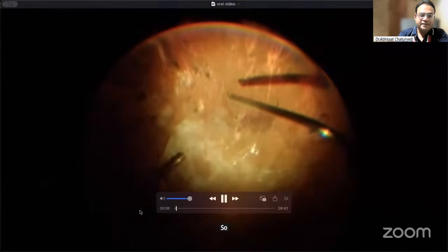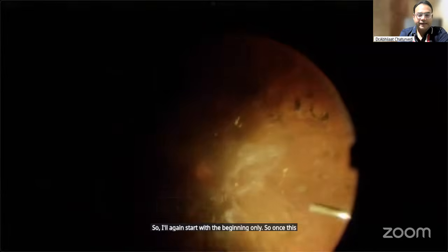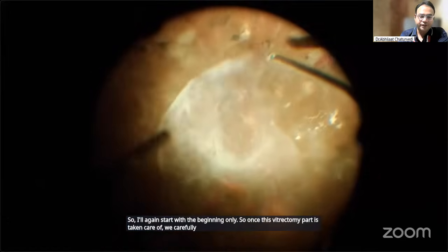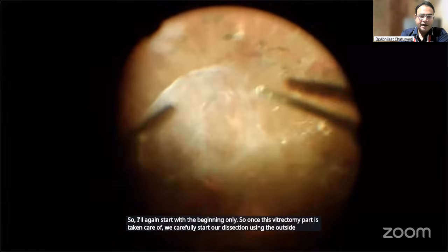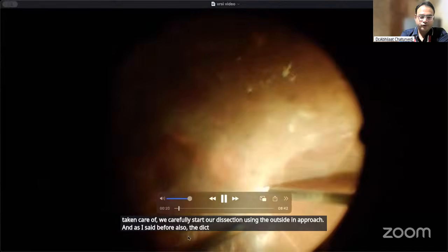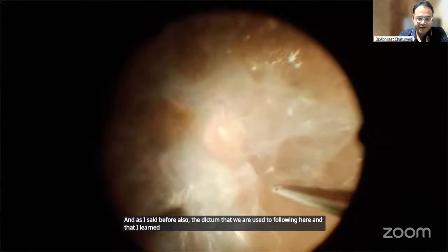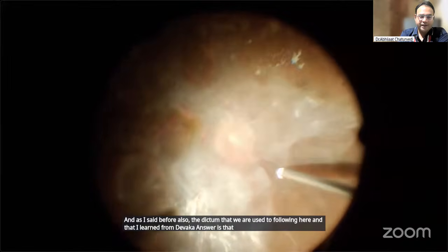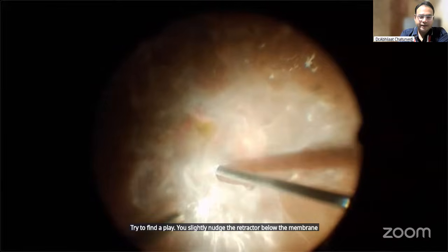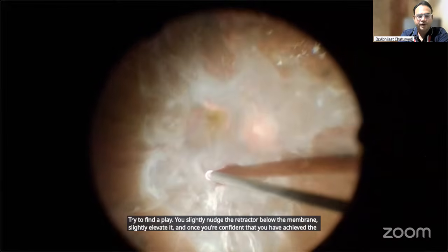So I'll again start with the beginning only. Once this vitrectomy part is taken care of, we carefully start our dissection using the outside-in approach. And as I said before, also the dictum that we are used to following here, and that I learned from Divakant sir, is that you try to find a plane. You slightly nudge the vitrector below the membrane, slightly elevate it, and once you're confident that you have achieved a plane, you can go ahead with your cutter.